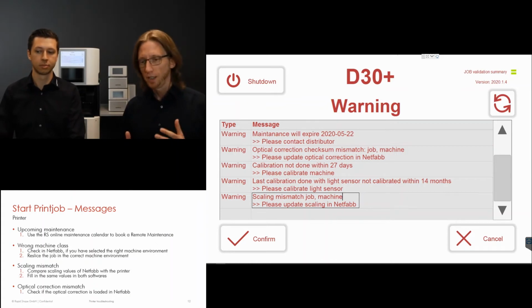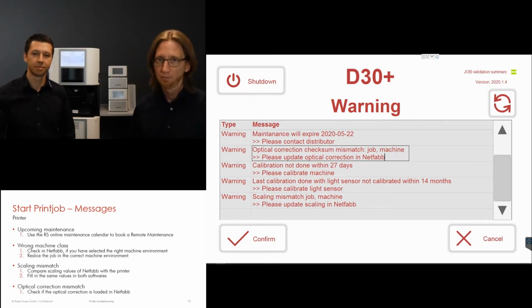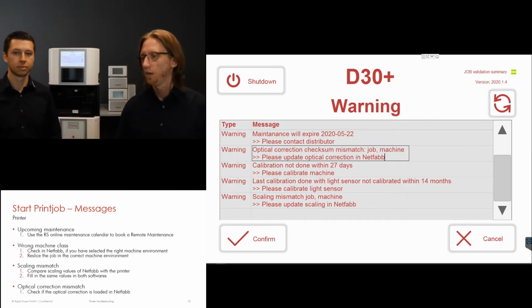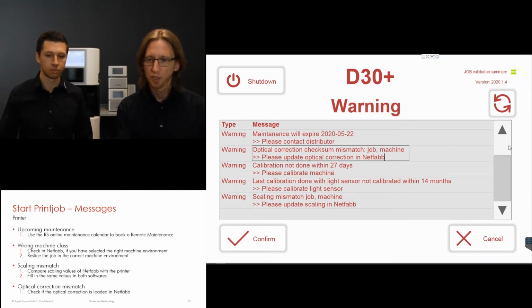Okay. Another thing which could happen is the optical correction mismatch. Thank you, Robin. This is also something which can happen, the same as with scaling factors. We have an optical correction file which is stored in NetFab, and we have an optical correction file which is stored on the machine. If this information is not matching, we get the checksum mismatch. The information about where to find the optical correction file is in previous webinars. It's on the flash drive of the machine, and there you can also find how to implement the optical correction file in the NetFab settings. All right, I think this is pretty clear.